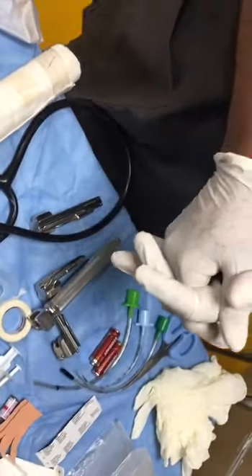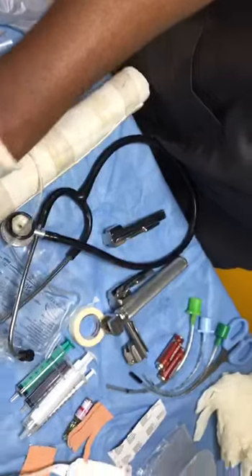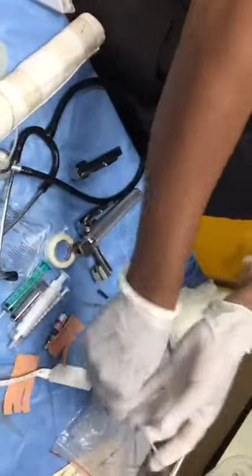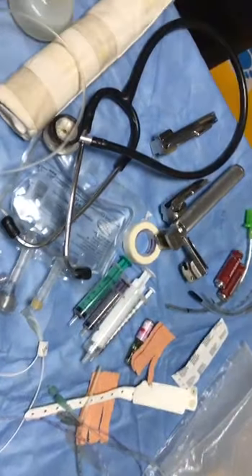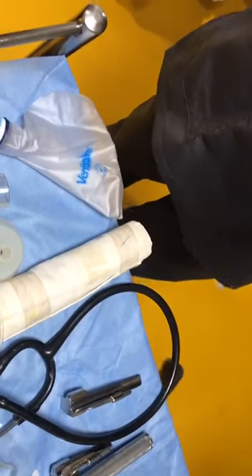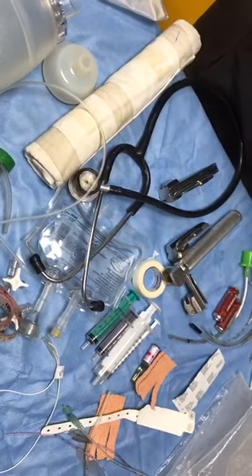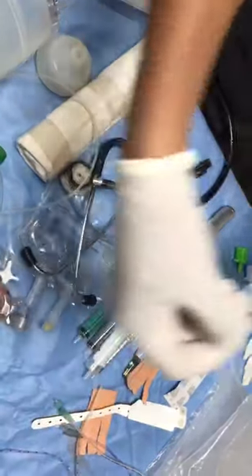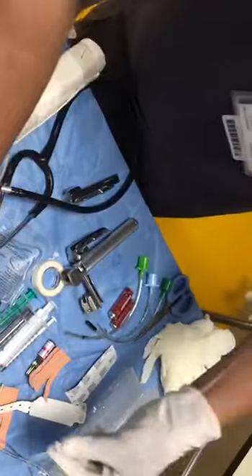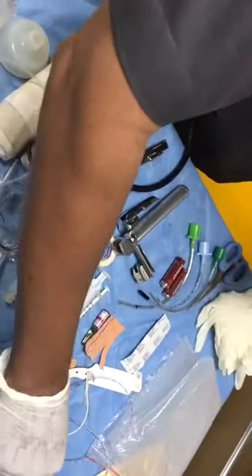If at all the baby needs positive pressure ventilation, we have the Ryle's tube to decompress the abdomen. I'm just going to use 8 or 10 French. It is there already. Coming to the medication part. Yes, so UVC is there. We have a UVC of size 5, if at all we may need to use it.